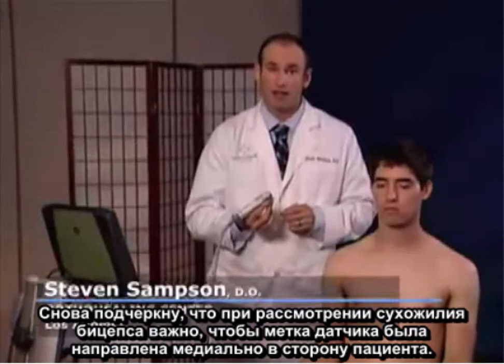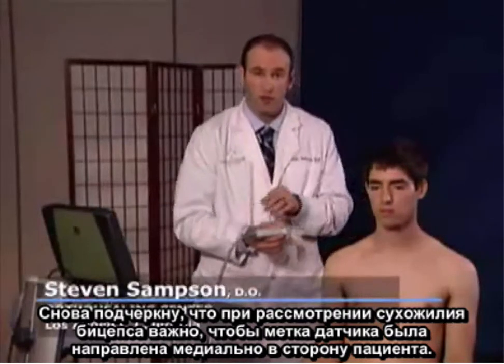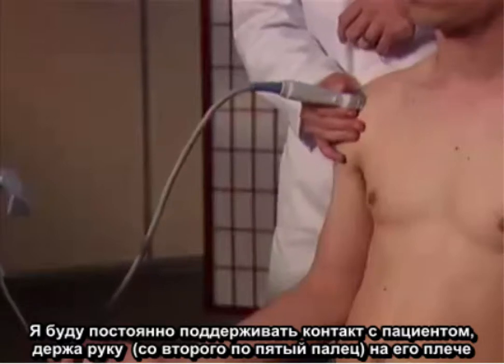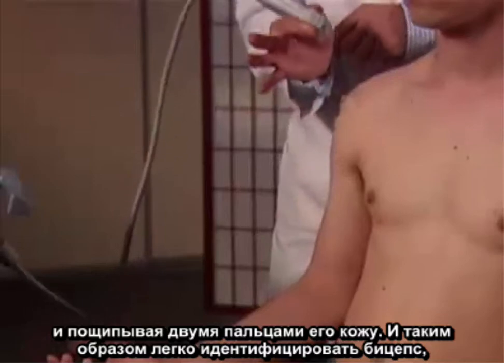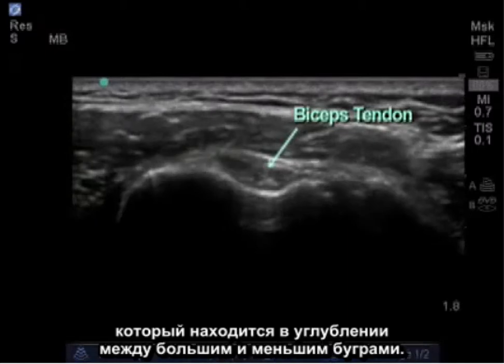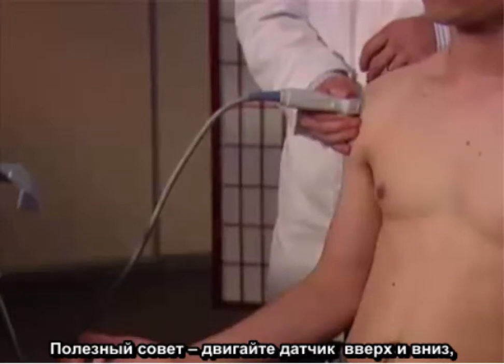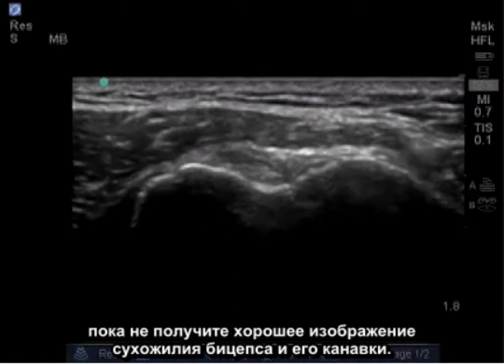In examining the bicep tendon, it's important to keep the notch of the probe medially facing towards the patient. I'm going to maintain contact at all times with my hand on the patient using my second through fifth fingers to form a base on the patient's shoulder, almost pinching the probe between my two fingers. It's fairly easy to identify the bicep which lies in the groove between the greater and lesser tuberosities. A helpful tip is to aim the probe both upwards and downwards until you get a nice image of the bicep tendon in its groove.